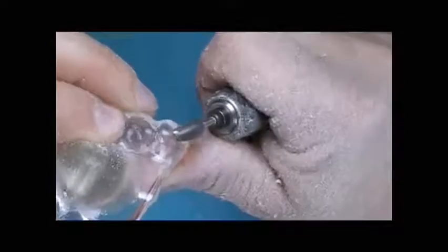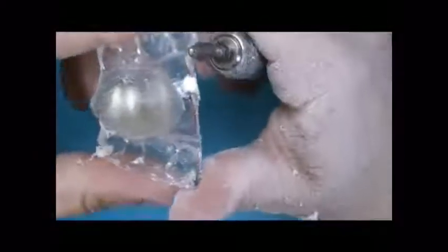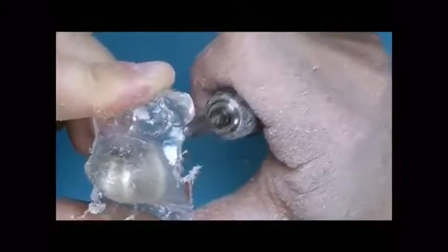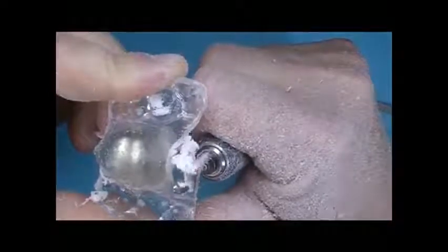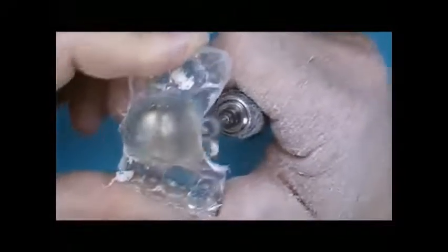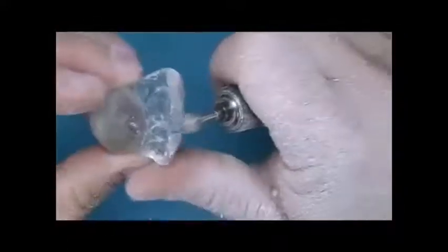The back of the appliance is trimmed to the distal end of the last tooth on each side of the arch. From here, the plastic is tailored 5 to 7 millimeters anteriorly towards the middle of the palate. All trimmed areas are rounded using the carbide taper burr.